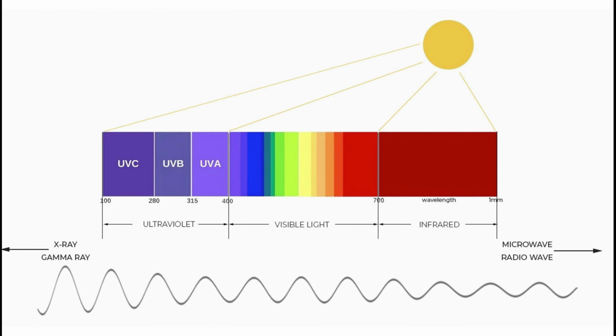When we previously looked at light absorption along the spectrum of ultraviolet to visible to infrared, we focused on the absorption at 660 and 940 nanometers to identify oxy and deoxyhemoglobin as part of the workings of the pulse oximeter. Now we are going to look into longer wavelength light, micrometer light, where CO2 is absorbed.